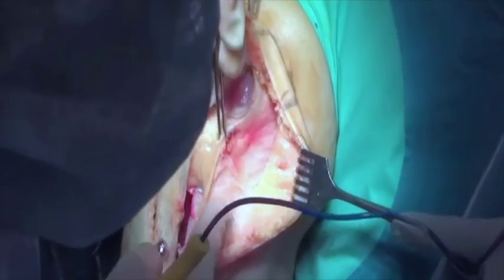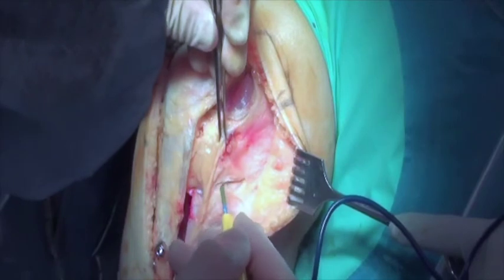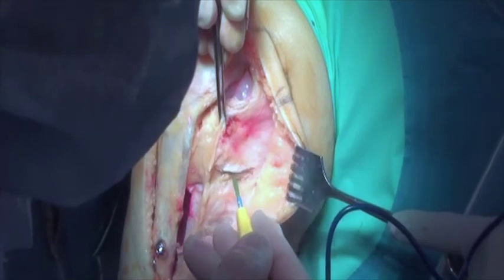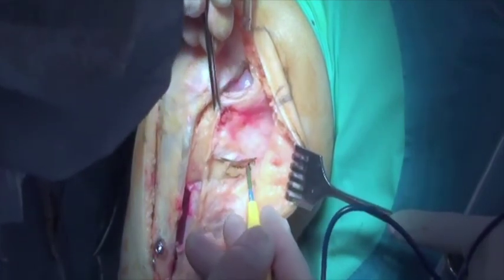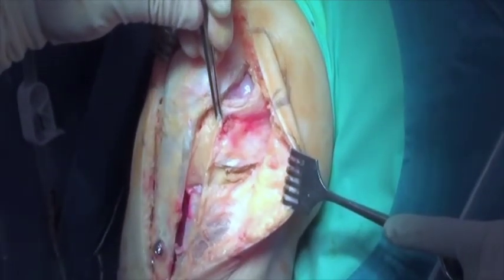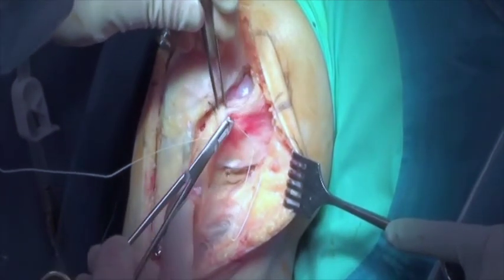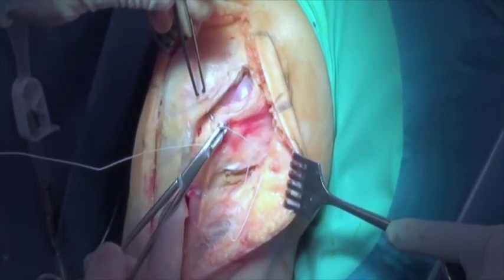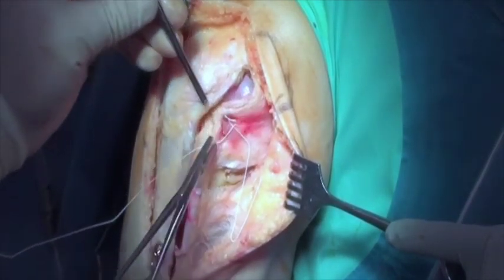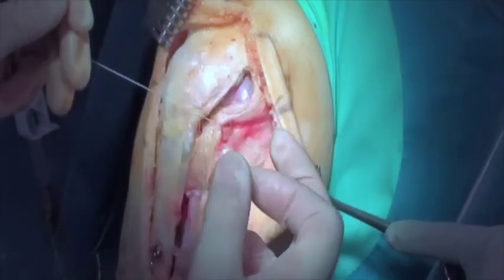Once the tubercle is secured in the corrected position, the defect created by the prior lateral release is closed by rotating a flap of tissue from the adjacent iliotibial band. A wide strip of the iliotibial band starting at the patellar margin and distally near the joint line is carefully developed, leaving the synovium intact. This strip of tissue is mobilized enough to allow it to be rotated up to the lateral side of the patella, preventing development of lateral side laxity and medial subluxation. The repair also restores the load-sharing function of the lateral retinaculum, and patellofemoral contact pressures are normalized.